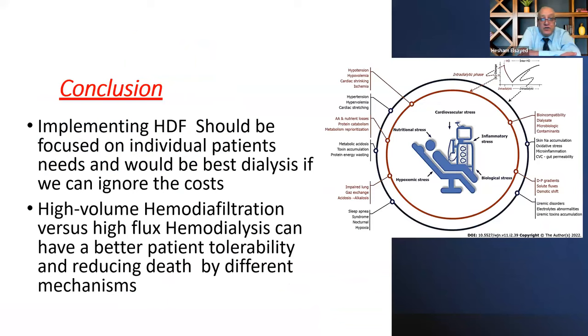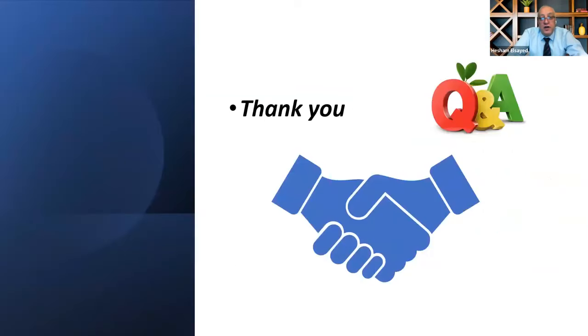We conclude that implementing hemodiafiltration should be focused on individual patients' needs, and it would be the best dialysis if we can ignore the cost. High-volume hemodiafiltration versus high-flux hemodialysis can have a better outcome and better patient tolerability, reducing all-cause death by different mechanisms, decreasing the intradialytic stress of machines, dialysate, oxidation, volume and ultrafiltration. Thank you very much.